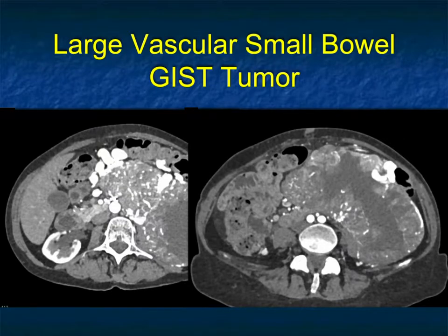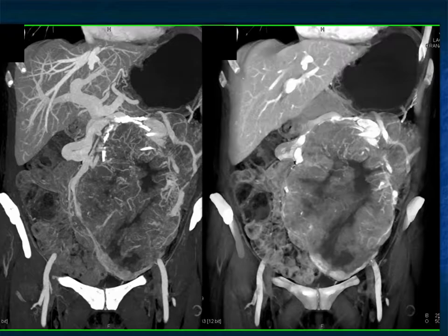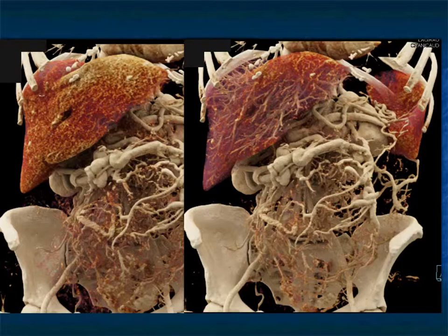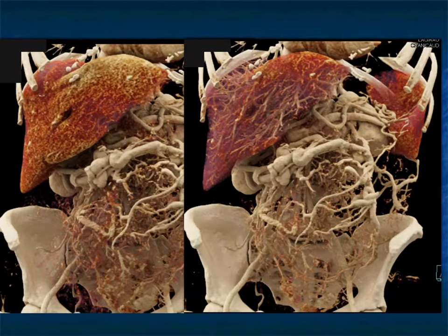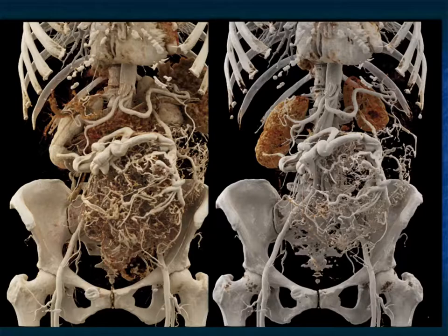Here's a patient with a large small bowel tumor — a GIST tumor with lots of vascularity. The surgeon wanted to resect it. At first glance you might say this can't be resected, but large GIST tumors are typically resected; sometimes they'll give Gleevec first and then resect. We provided the vascular maps so that when the surgeon went in, they knew exactly what vessels they would be seeing and what vessels they would have to sacrifice. Here's the vascularity in the tumor proper with the large prominent collateral vessels, and the preoperative plan — the surgeon knows what they can expect.